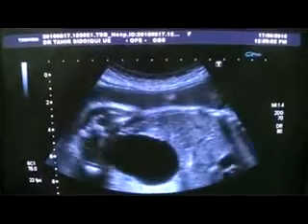You can see this is the liver, and this is the heart flickering in front of you.